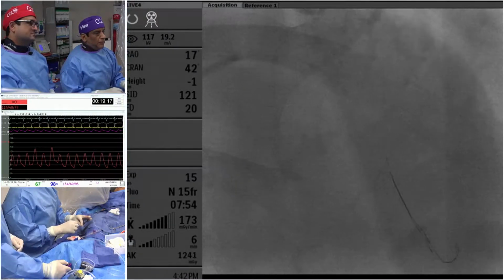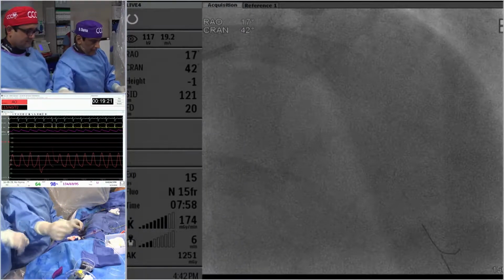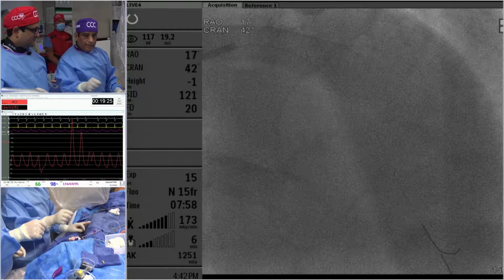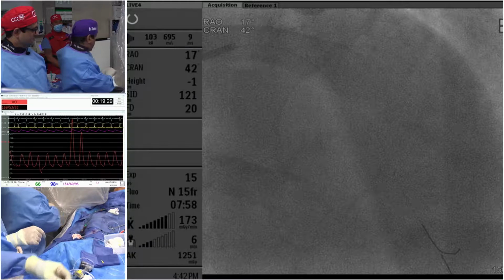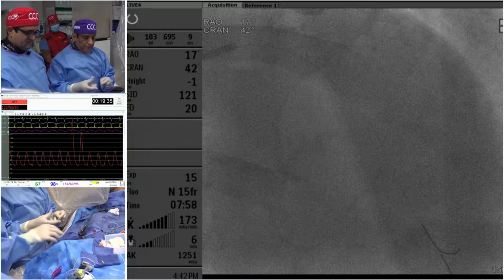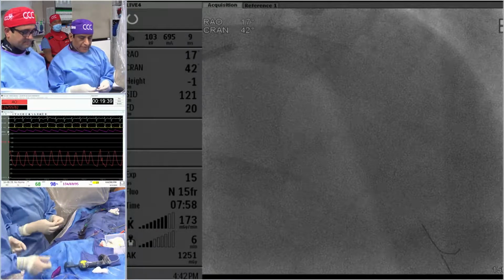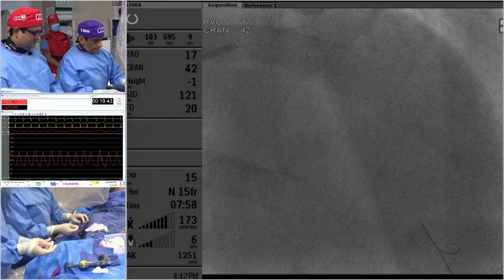I actually have a very low threshold of wiring the side branches while you are stenting. SS, can you do an OCT on that left main? I think that might be even more interesting. That could be a possibility also, yes. But you're going to fix that ulcerated plaque, right? Yeah, no, actually, you know what? Very interesting. This plaque was there last year, in the 2 angiograms, exactly the same way. So the question is if it's only ulcerated or there is also stenosis there.